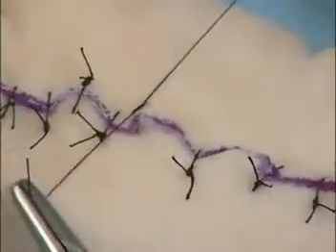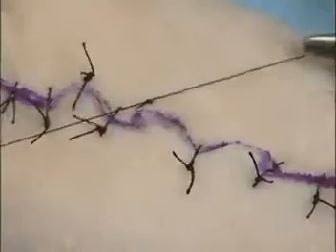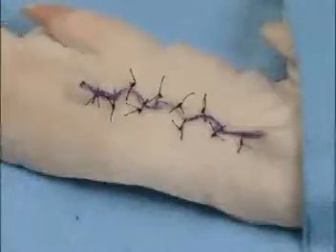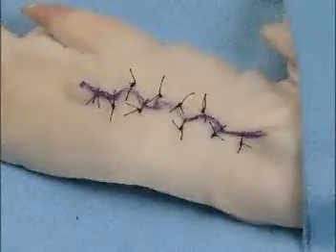And again, that is not necessary at every site. It can be used when you think there's a concern about the blood supply to the tip of the flap. That shows the conclusion of the closure.